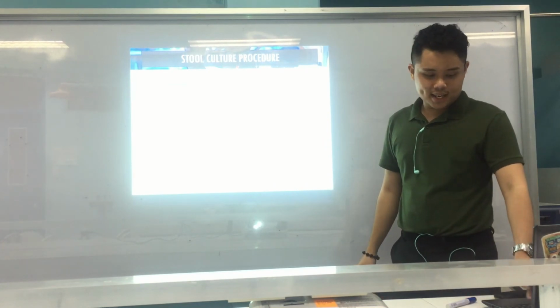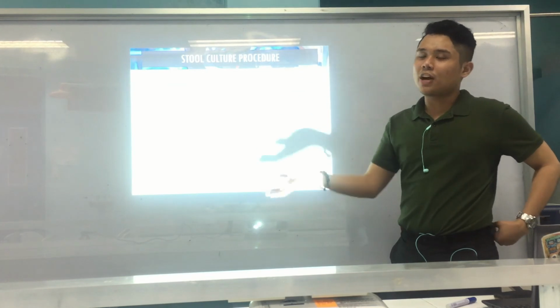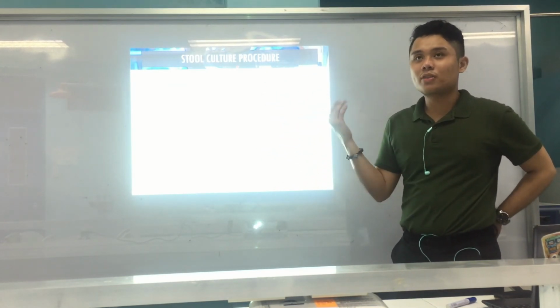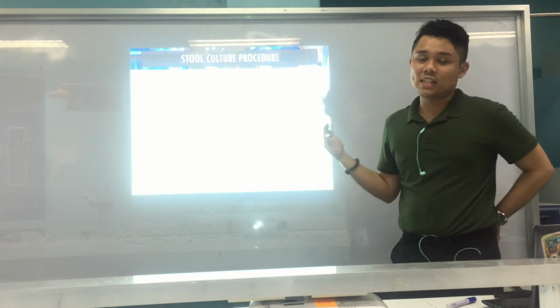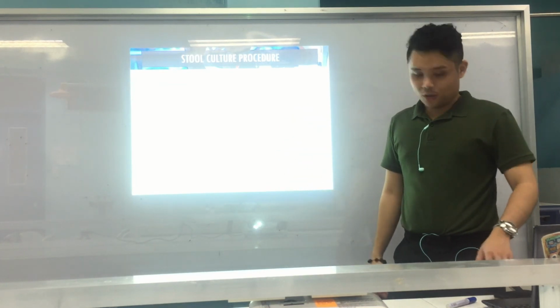Okay? Alright. And again, perform the appropriate workup. When you say workup, for example, if I see an isolate that is a colorless non-lactose fermenter, what is my next step? What tests do I perform? Do you perform TSI? Citrate, etc., until you reach the identification or identity of the organism.